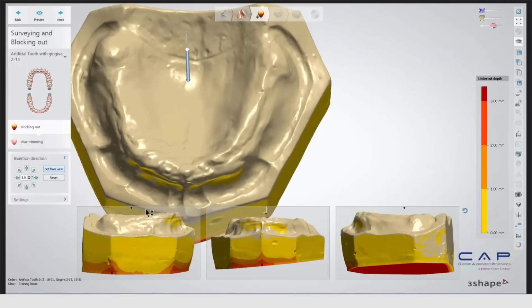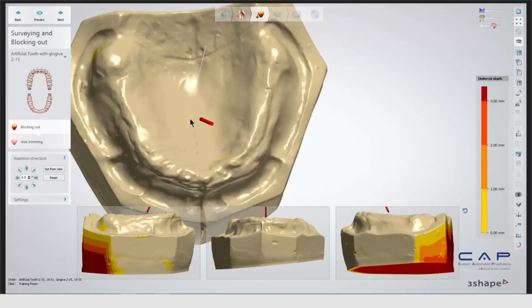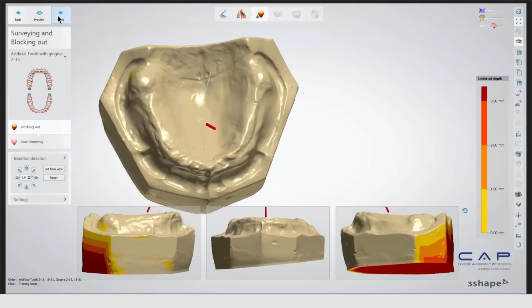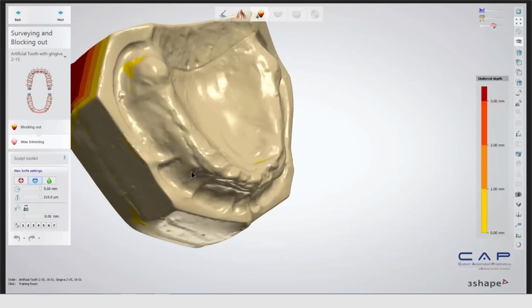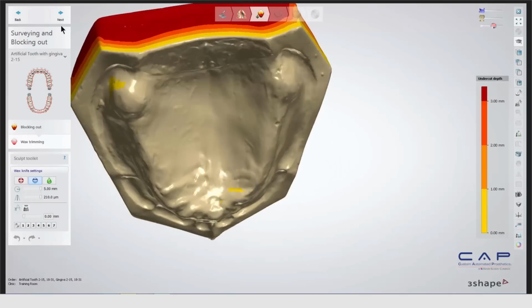And I'm going to hit the Set from View button to maximize my view from this angle. Now anywhere that was in an undercut area is now going to be appearing in yellow, and that's okay because that's within the 0 to 1 millimeter range of undercuts. Now we can go on to next, and we can do some wax trimming. So if you wanted to, you can wax out those undercuts to prevent them from being there. But since they're yellow, we don't have to worry about these ones. They're not going to be impeding too much.